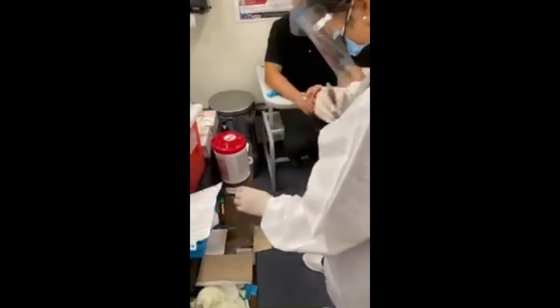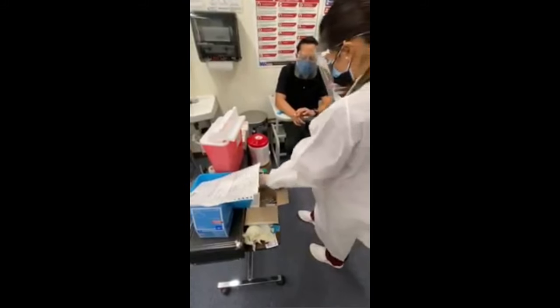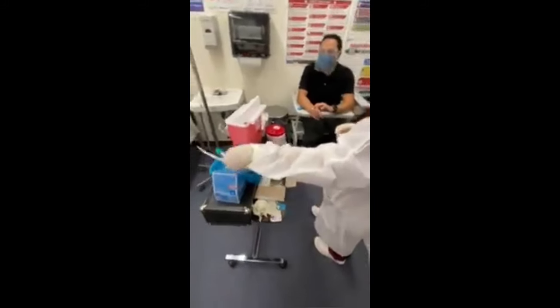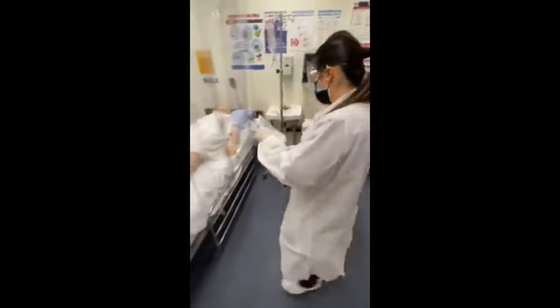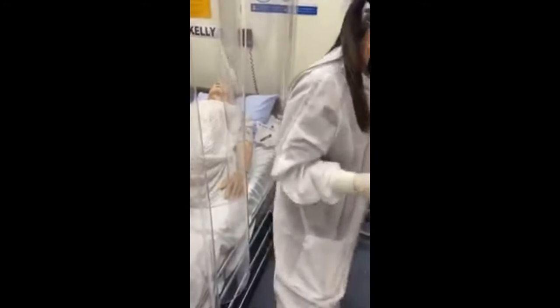9 p.m. Okay. So let's say you already labeled your tube. What do you do with a tube and a requisition? I give it to the tech. Okay, go ahead and give it to the tech. Okay, so now you can go back to the patient.